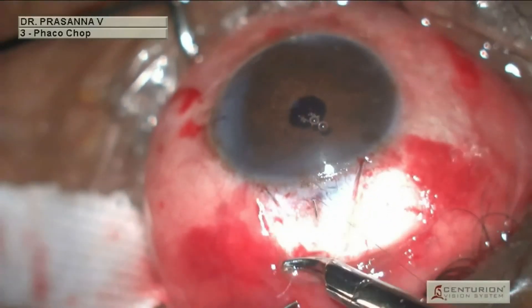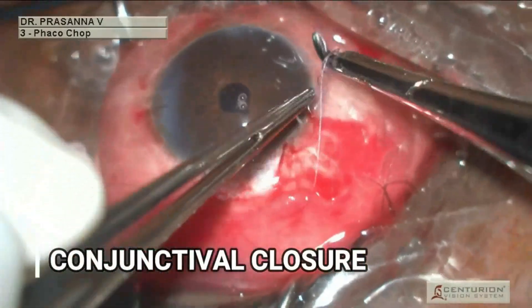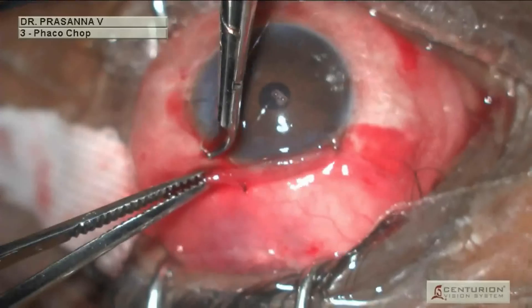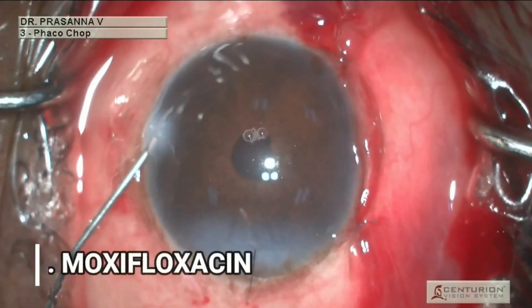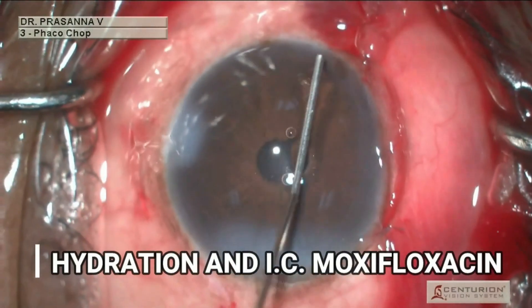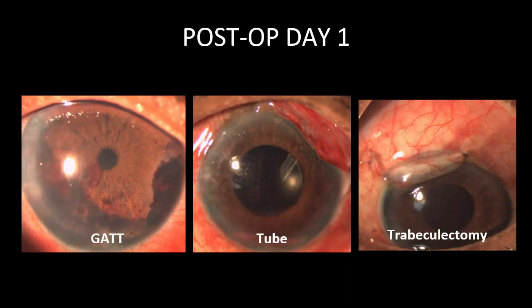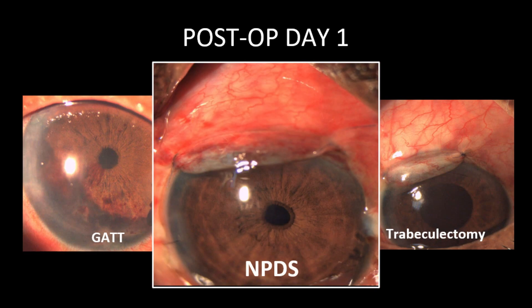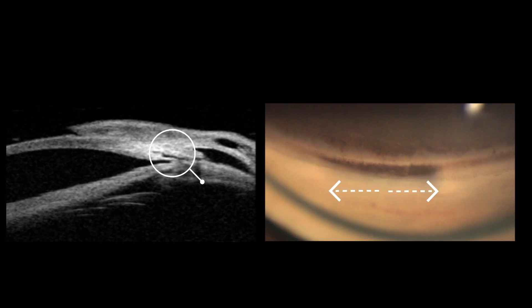Finally, the scleral flap and conjunctiva are closed. This slide shows post-op day one images after different glaucoma surgeries — note how quiet the eye is after NPDS. Post-operatively, one can image this window by UBM and gonioscopy as shown here.